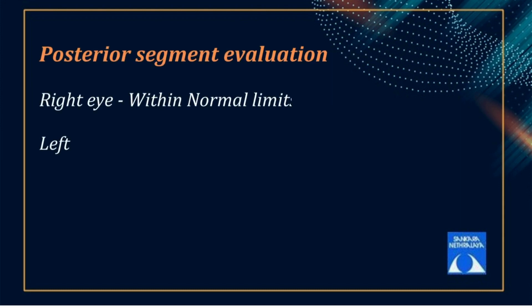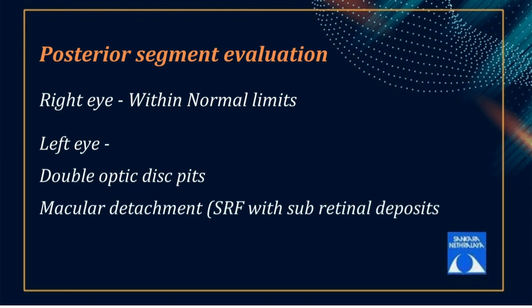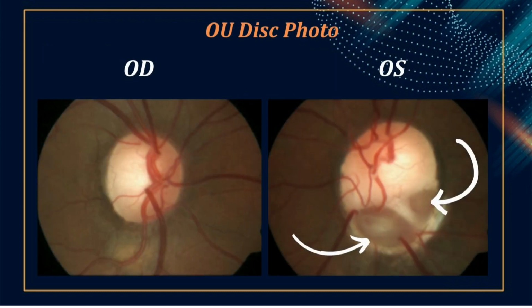Fundus evaluation of the left eye showed double optic disc pits with macular detachment, that is, subretinal fluid with subretinal deposits. Retinal pigment epithelial changes over the macular region were also noted. The macular detachment, however, did not seem to have any obvious connection to the disc pits. Both eyes' disc photo was taken and the findings are as depicted.